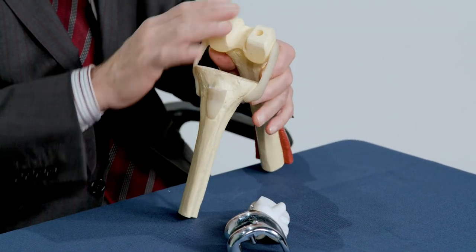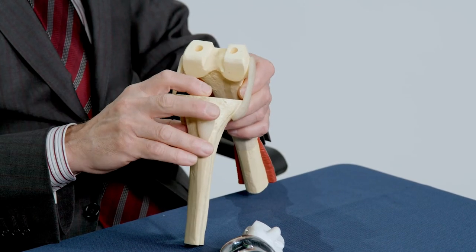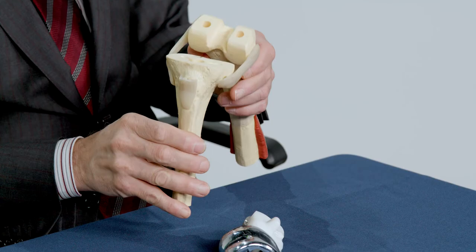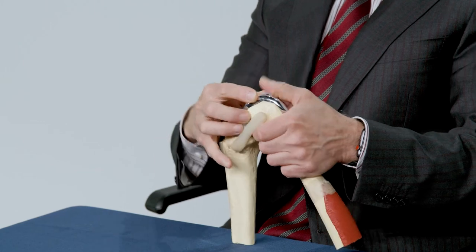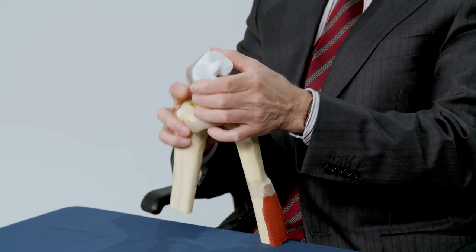The surgeon removes the damaged surfaces of the bone on the femur, which is the thigh bone, and the tibia, which is the shin bone, as you can see here. The damaged ends of the bones are replaced with pieces of metal, typically made of a combination of titanium, cobalt chrome alloy, and a plastic liner.